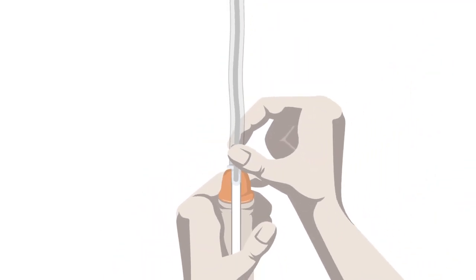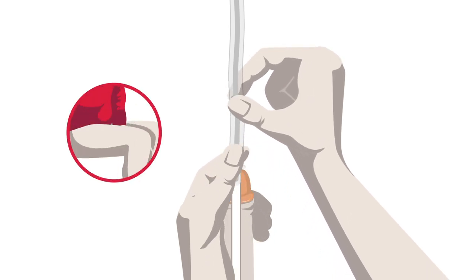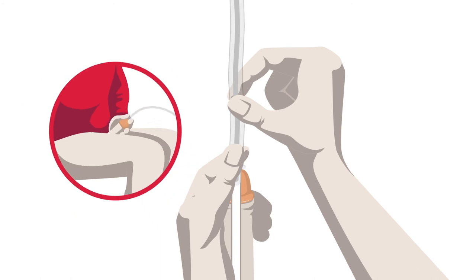After you have inserted the protective tip in your urethra as advised, you can hold the protective tip in place with the thumb and forefinger of your non-dominant hand holding your penis, pointing it in a slight upward direction. This helps to extend the urethra and can make it easier to insert the catheter.